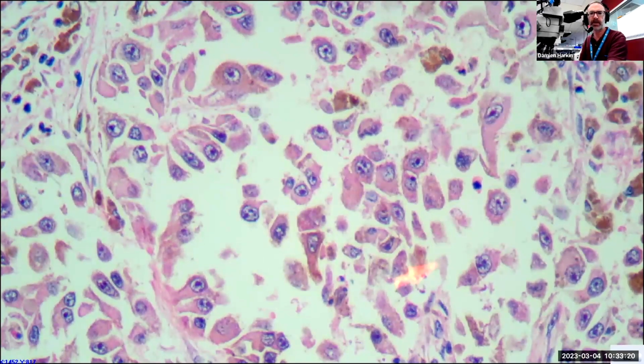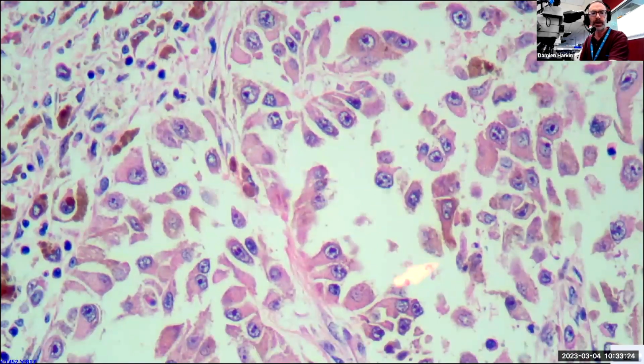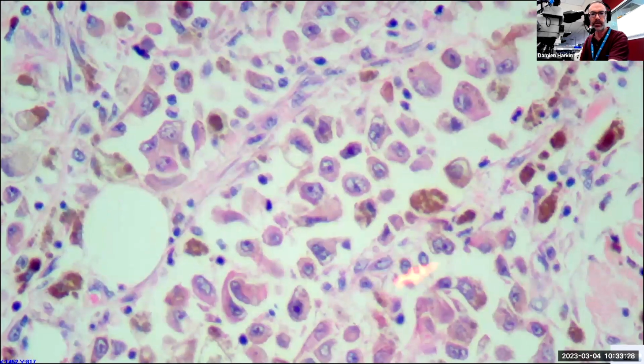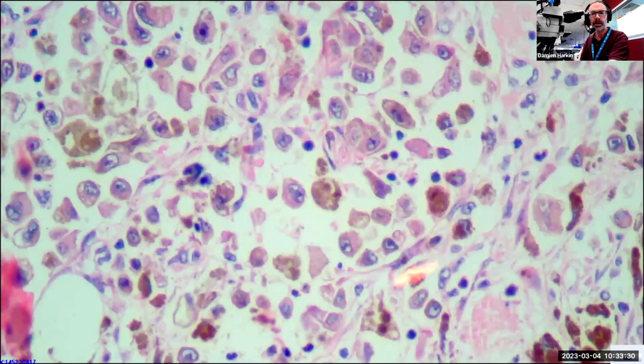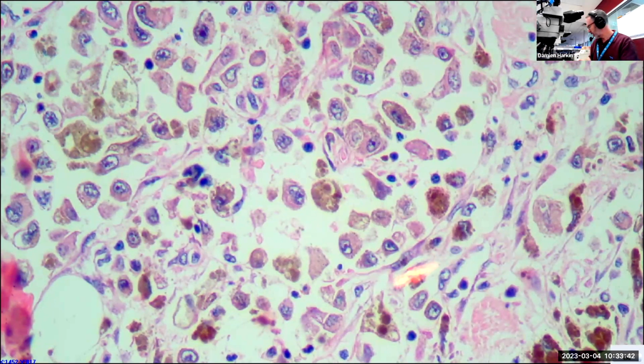So it's not really complete. In fact, there's some areas here where it's almost as brown as what we just saw in the earlier example. Okay, so not a perfect example, but when performed correctly, and I think we'll come back to this next week just to prove that point, you can actually remove it quite effectively.